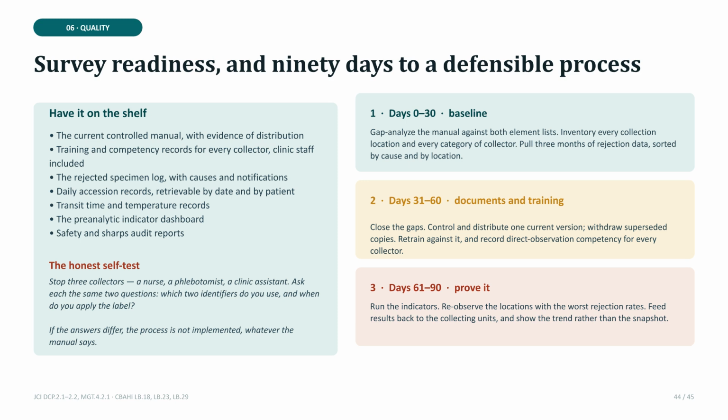Chapter 6 covers quality. Retention periods are absolute minimums. Local law may dictate longer storage. Ensure your disposal procedures are consistent from the collection point through to contracted third parties, including the respectful management of human remains or tissue samples.